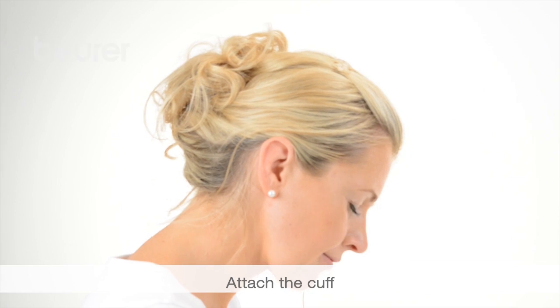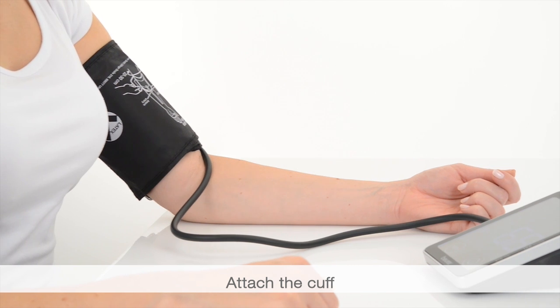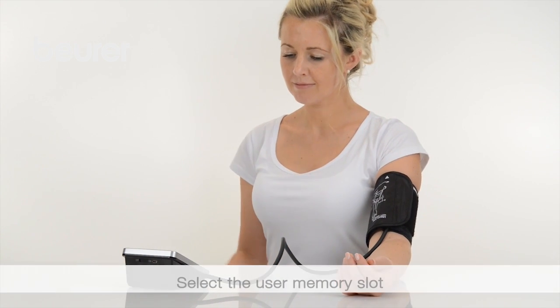The cuff must be level with your heart. The line points to the center of the palm. It should be possible for two fingers to fit under the cuff. Press start stop.